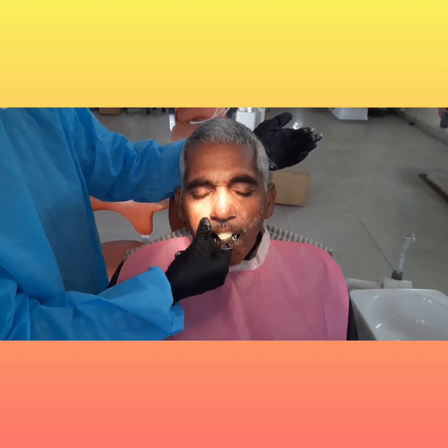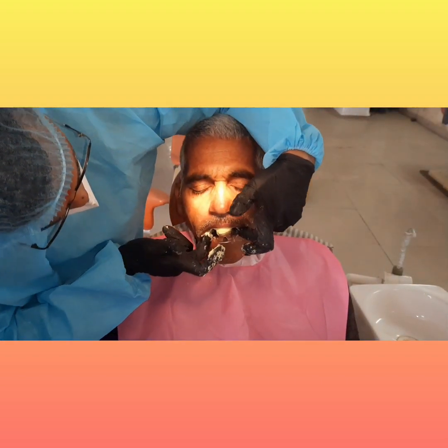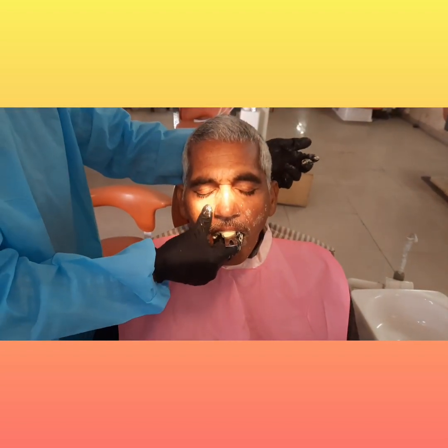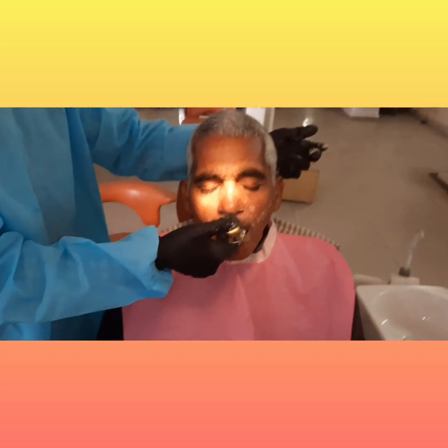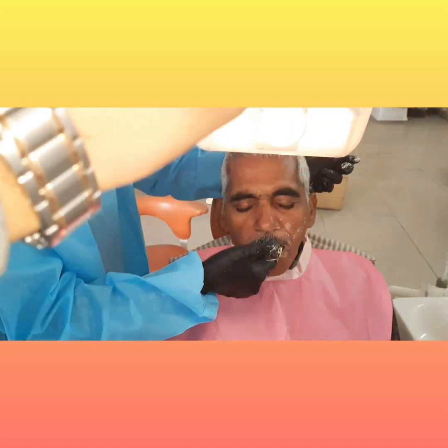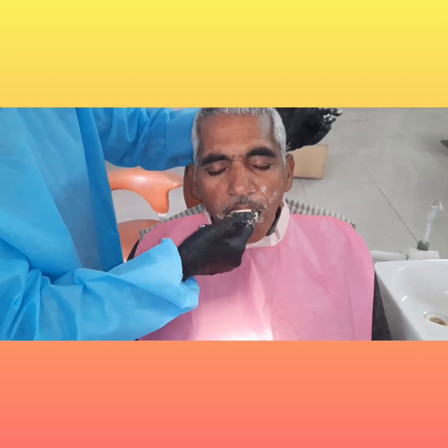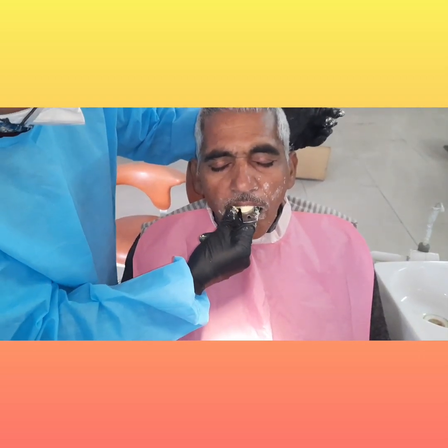Allow the material to set. Once set, as with the lower impression, remove it in one snap rather than in a slow motion.